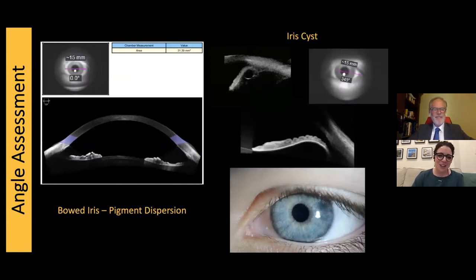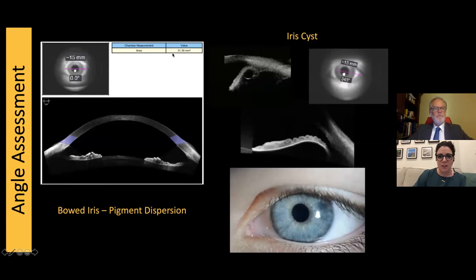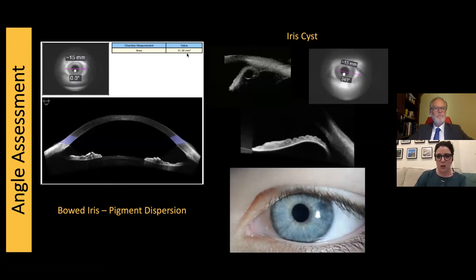Other uses of our anterior segment OCT: we can evaluate and monitor patients with pigment dispersion. This is a nice image showing the bowing back of the iris in pigment dispersion. Notice the vast difference in anterior chamber depth — the anterior chamber is so much larger in patients with pigment dispersion compared to our narrow angle patients. Get used to looking at those numbers.